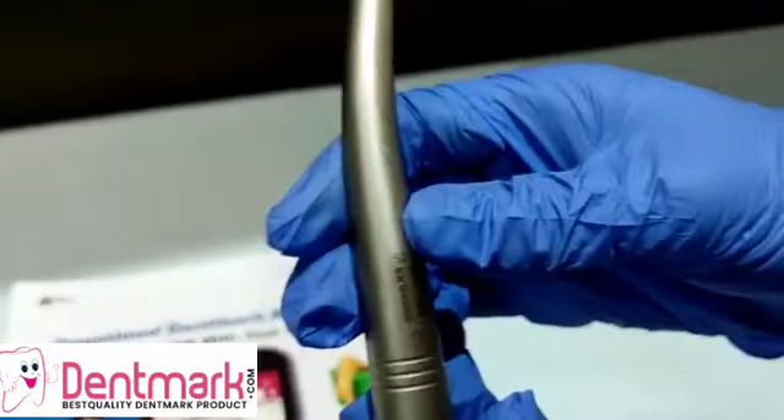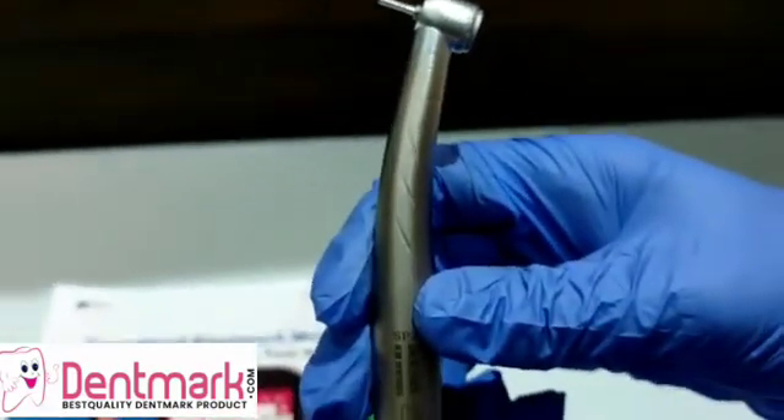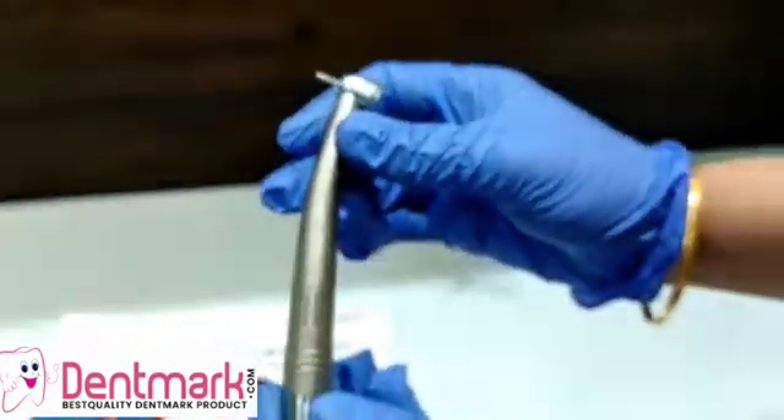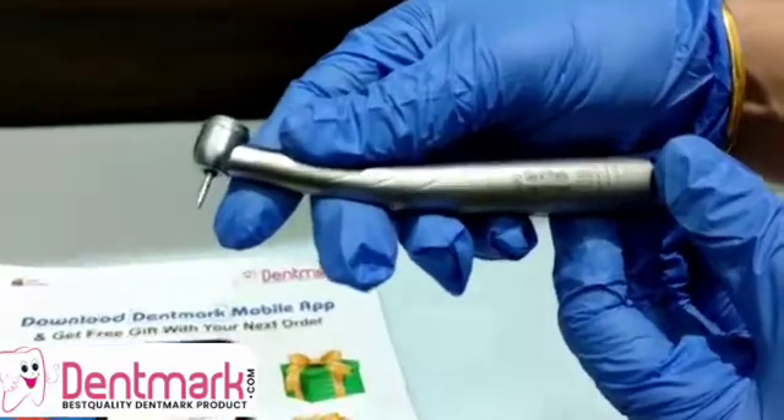The body of this handpiece is made of titanium and the ergonomic design is very useful for the grip. It is light in weight and very cost effective as well.